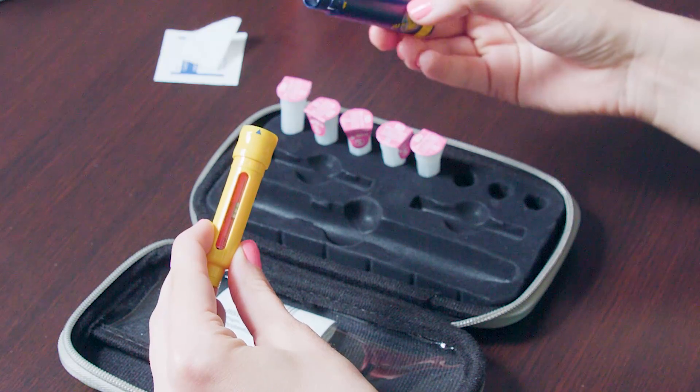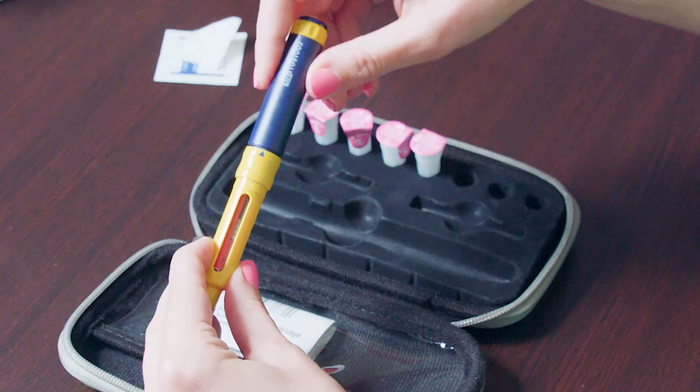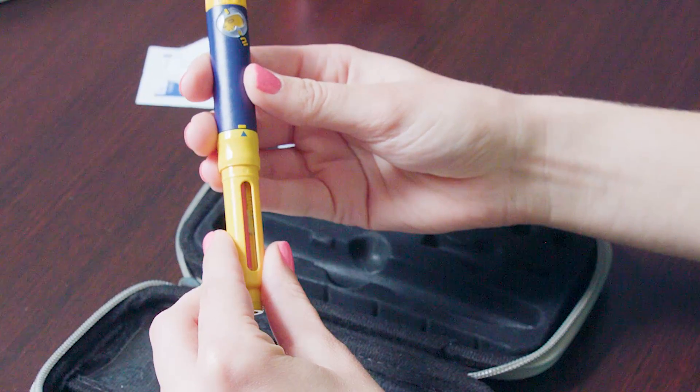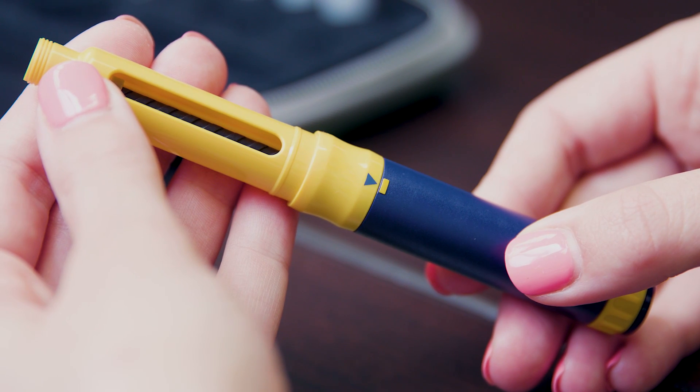Take the blue section of the pen and screw it into the yellow section completely. Make sure that the skinnier black portion of the pen reaches the inside of the cartridge. The arrows in the center of the pen must match up before proceeding.